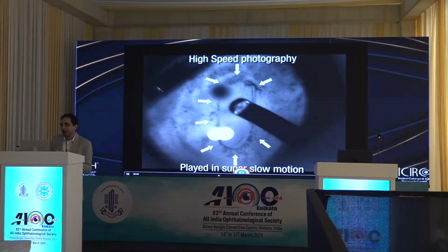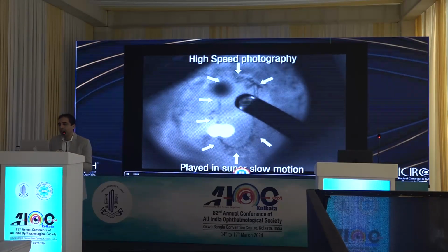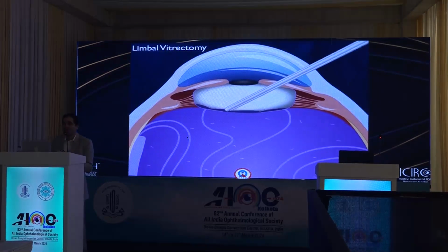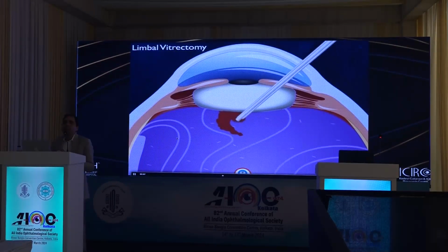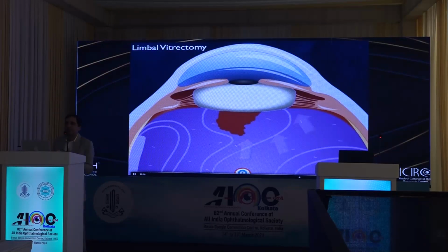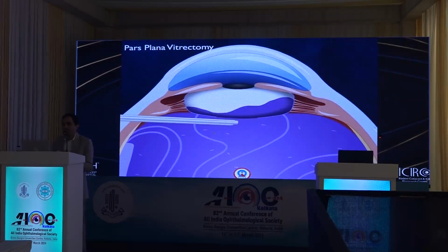Notice this again: the irrigation is through the limbal approach, the vitrector is through the pars plana, and there is very minimal turbulence occurring at the edges of the posterior capsular tear. Like Dr. Megur showed very nicely how to approach it face down, the only limitation with the limbal approach is that in spite of changing hands, the ergonomic access is generally limited, and therefore there are chances of leaving behind unequal pockets of vitreous around the area of the PCR, which may lead to some tilt of the IOL in the post-operative period.